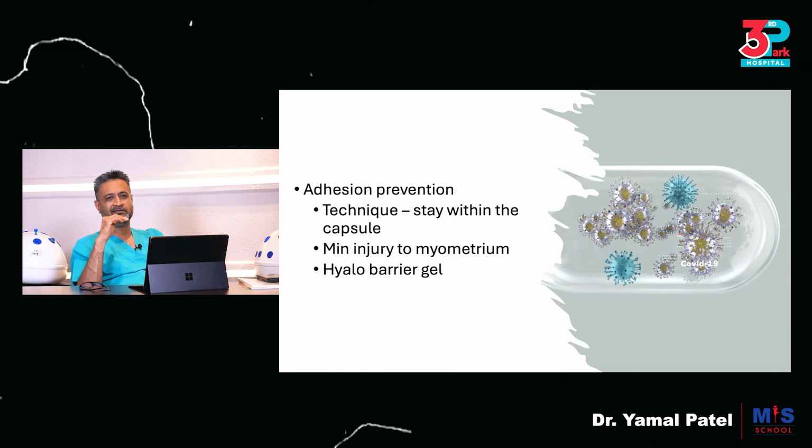Adhesion prevention, technique. Even in laparoscopy, even in hysteroscopy, I think one of my biggest tips to avoiding adhesions is staying and operating within the right planes. If you operate within the right planes and you respect tissue, not mishandle tissue, not cause unnecessary damage to tissue, not cause dryness to tissue in laparoscopy, then you'll actually not leave too much bleeding. We'll actually not have adhesions.